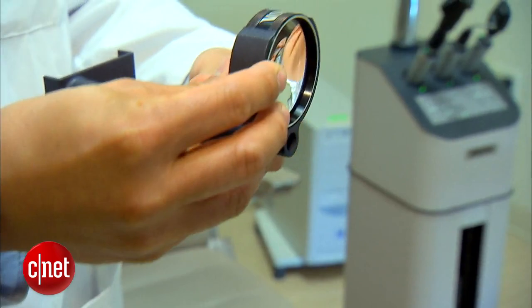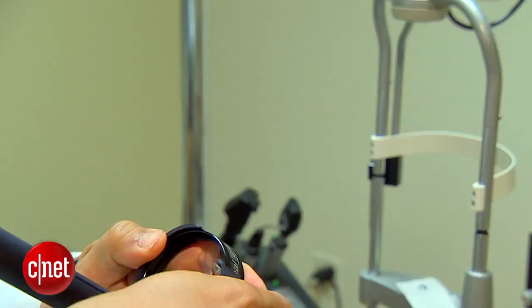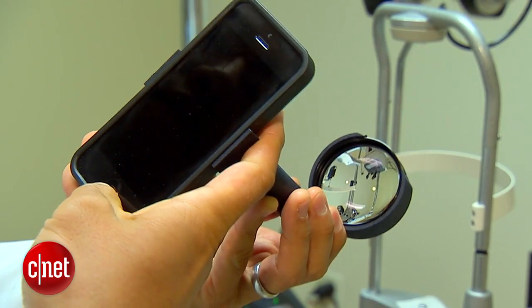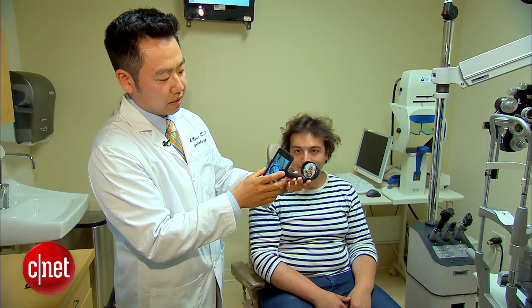It's an inefficient practice, so a team of ophthalmologists at Stanford University came up with another solution involving their smartphones. They developed an adapter called the iGo adapter, designed to easily take photos of the front and back of the eye. iGo makes use of items an ophthalmologist likely already owns — a condensing lens and an iPhone — keeping costs low. The early estimate is under $100, while traditional instruments run thousands of dollars.